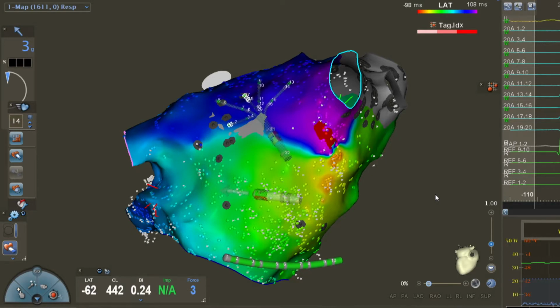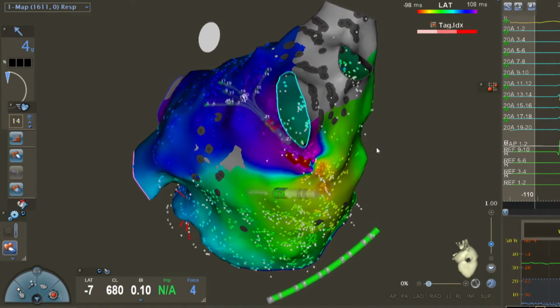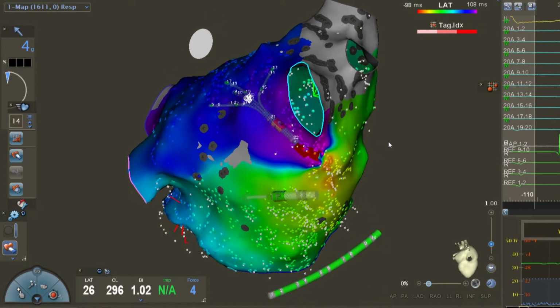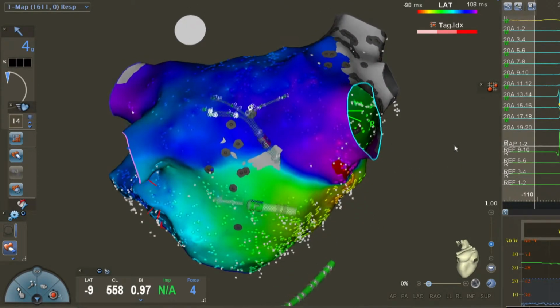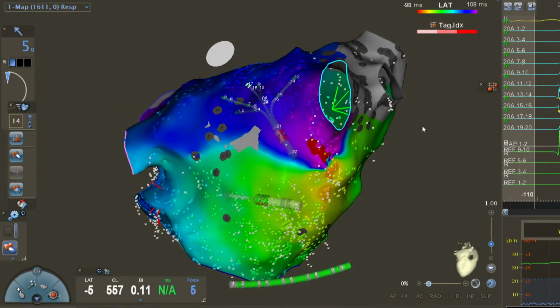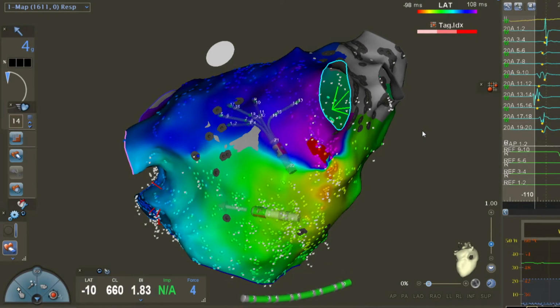Okay, here the arrhythmia circuit could be easily elucidated even from this LAT map. Probably the re-entry travels around the right pulmonary veins. So both superior and inferior connecting lines created by the surgeons on the epicardial surface with the intention to isolate the left atrial posterior wall are incomplete, not transmural.